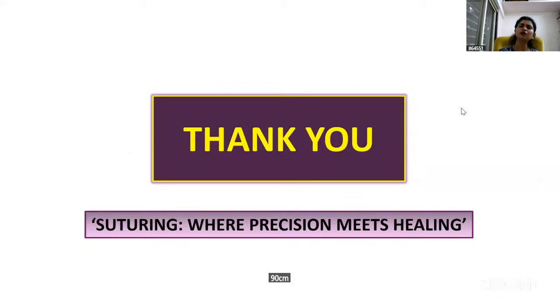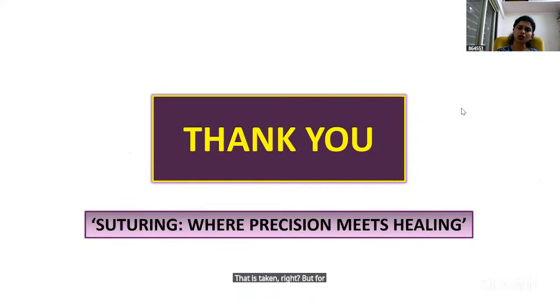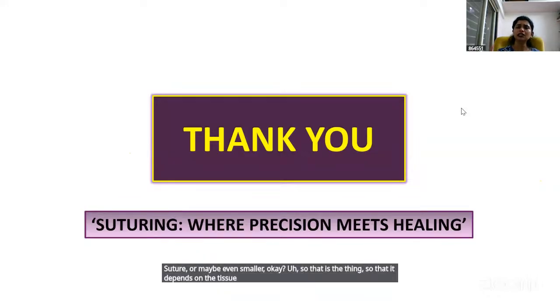I would obviously go with a longer thread where I have to use a continuous suture and a longer laceration or incision. But for a shorter one, I would not want to waste the suture thread, and I will use a smaller one, maybe 45 centimeters or even smaller. So it depends on the tissue. The decision making is multifactorial.